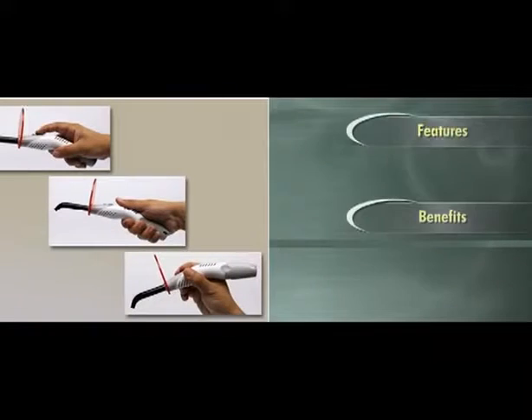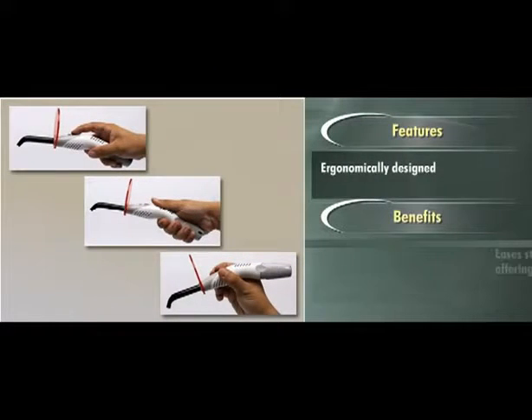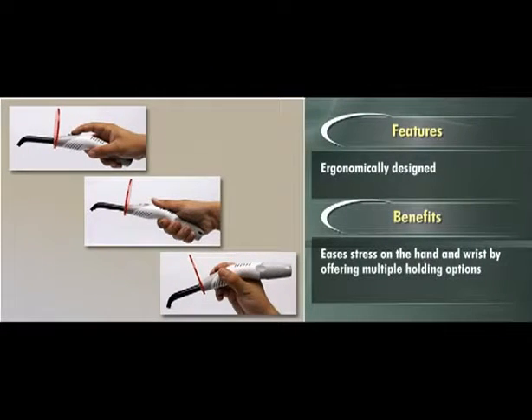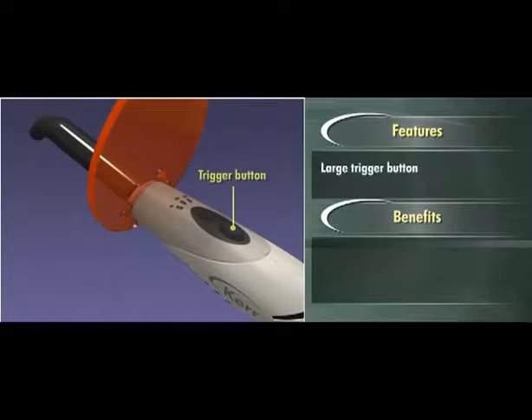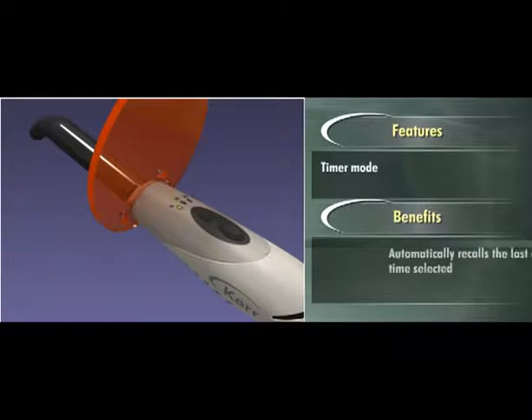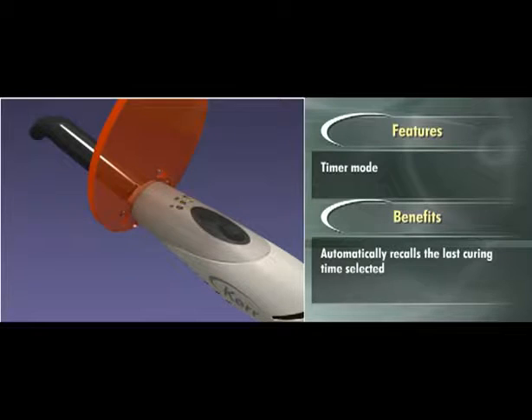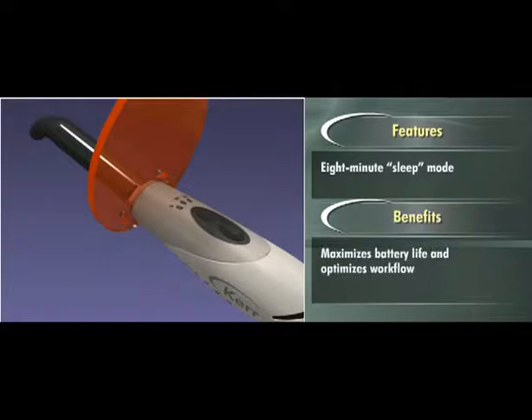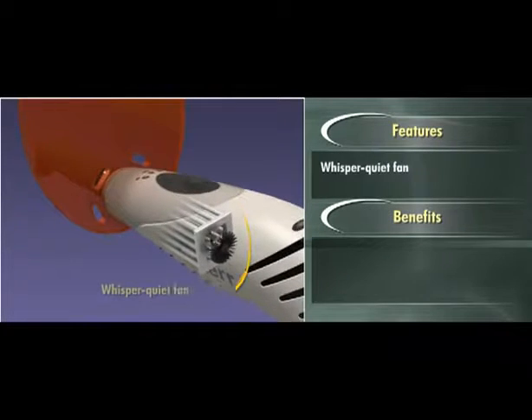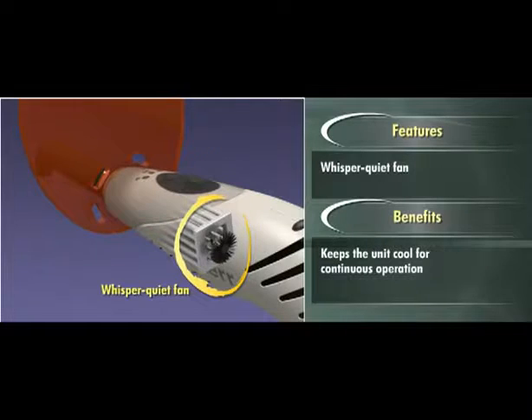Demi Plus was also ergonomically designed to ease stress on the hand and wrist by offering multiple holding options. The large trigger button makes it easy to initiate a cure and the timer mode automatically recalls the last curing time selected. The 8-minute sleep mode maximizes battery life and optimizes workflow while the whisper quiet fan keeps the unit cool for continuous operation.